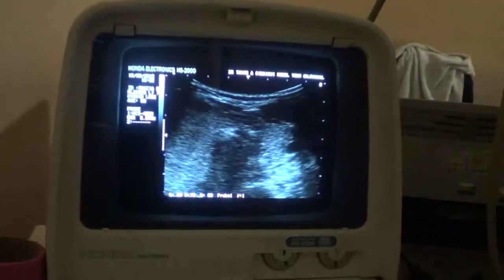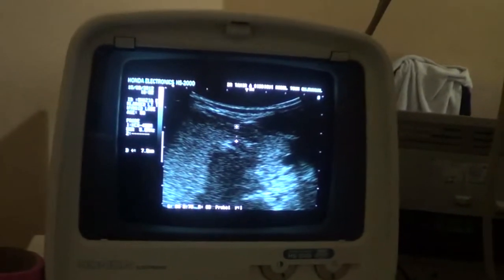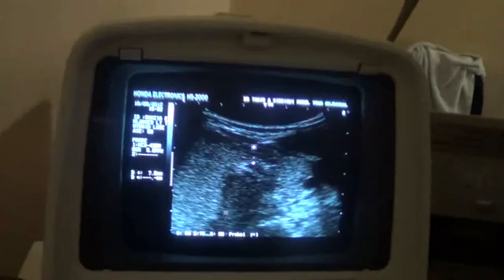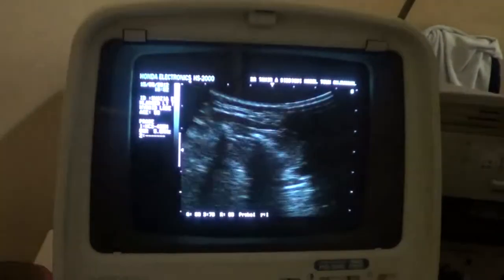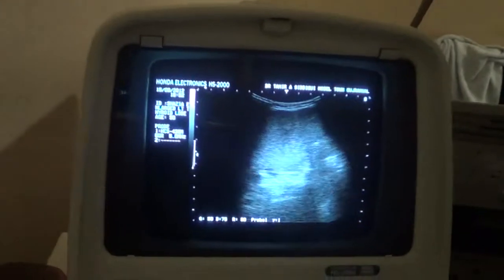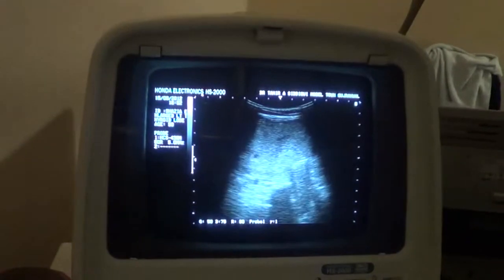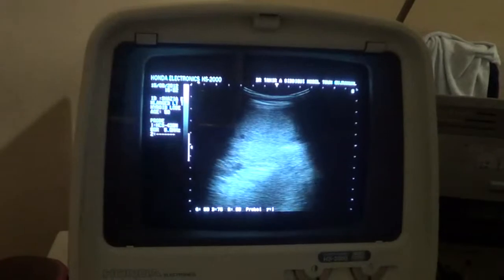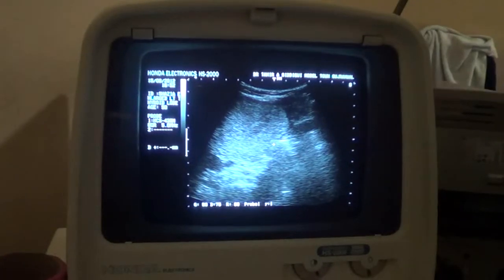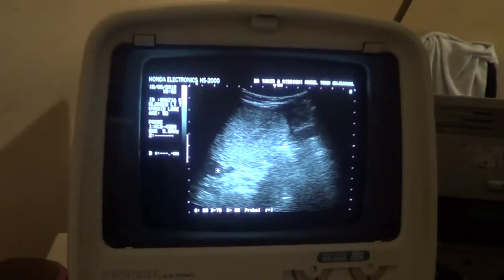So now again in transverse section, what you are seeing here is the isthmus. The isthmus is of normal dimension, normal echogenicity. Left lobe, common carotid artery, and this is the tracheal air shadow. Now I am going to move towards the right side of the patient. Here is the common carotid artery in transverse section, internal jugular vein in transverse section.